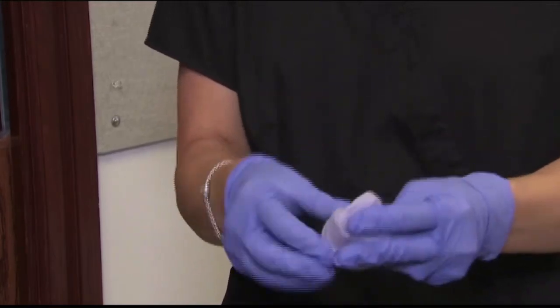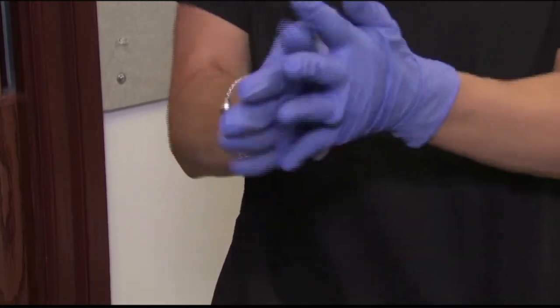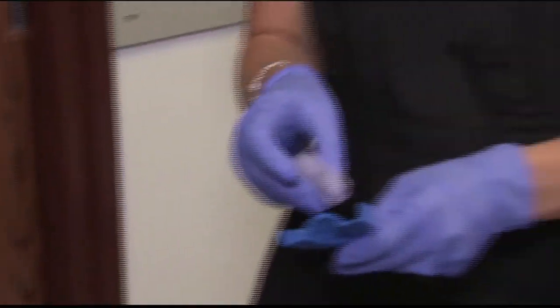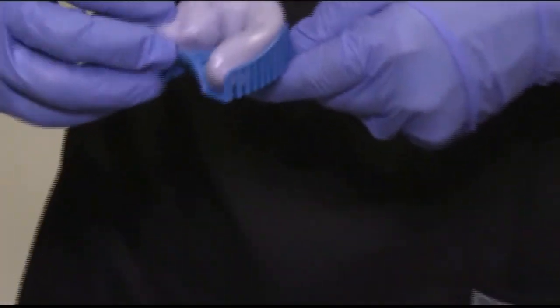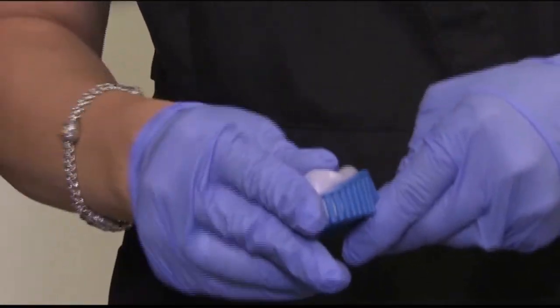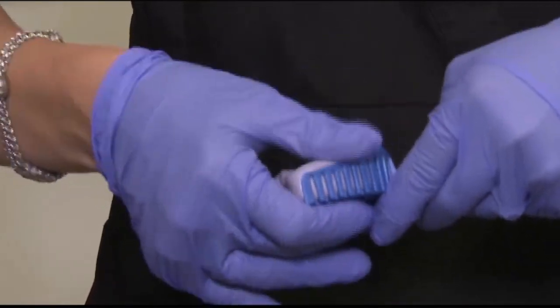We're going to keep rolling it, kneading it, folding it, moving pretty quickly because the hands are warm, so it's going to accelerate the setting time. So you want to get moving. I'm going to roll it into a hot dog. I'm going to lay it into the tray all the way around. And then I'm going to flatten it out, making sure it's nice and flat. I want enough material to go up and over the tray edges just a little bit.